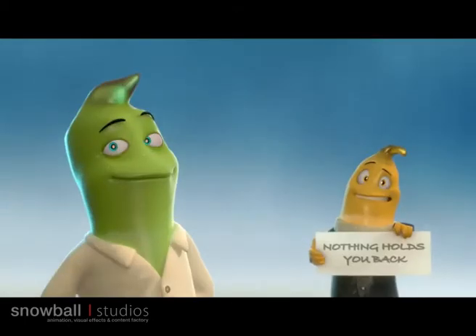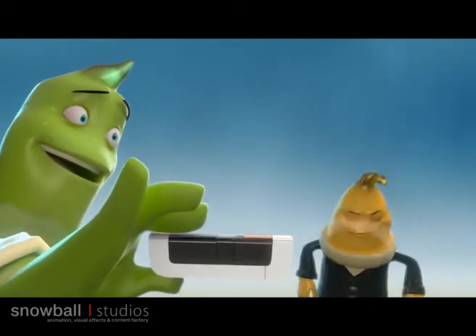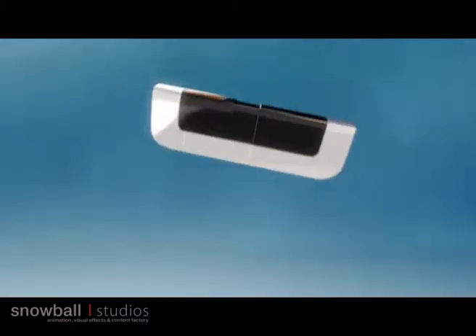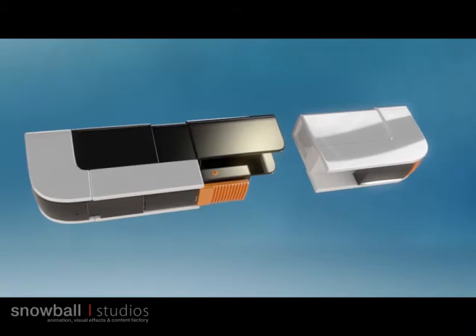Many people want to know how to use Dario. First of all, you have to have one. Because when you have Dario, nothing holds you back. Your Dario comes with a meter that connects directly to your smartphone, and a cartridge containing 25 test strips.